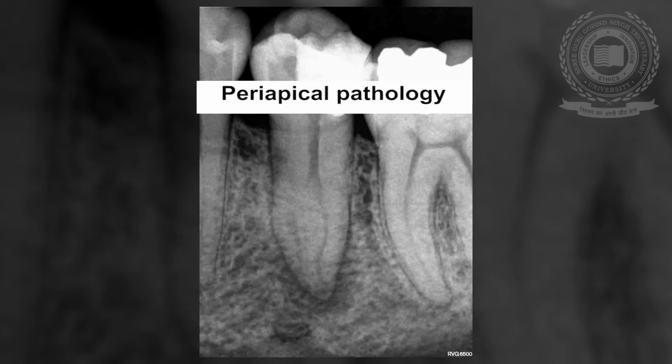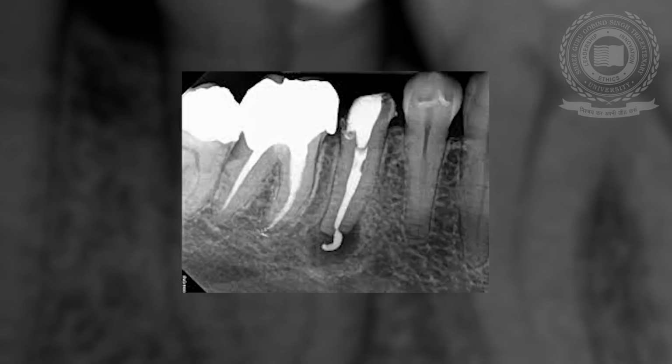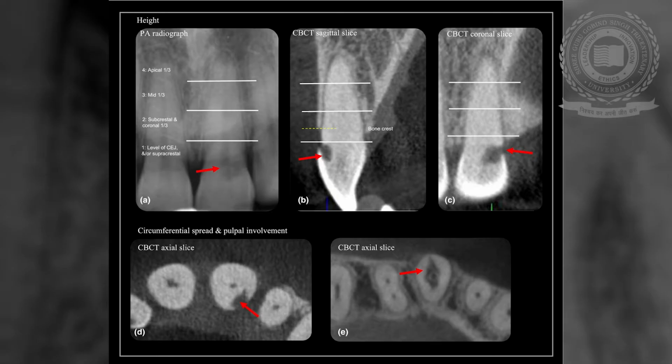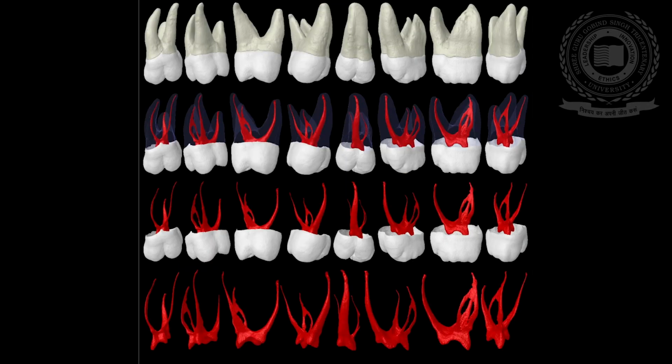Endodontic applications of CBCT include differentiation of dental and periapical pathosis from normal anatomy and relationship with important anatomical structures like sinus and inferior alveolar nerve canal. CBCT aids in management of dens invaginatus and aberrant pulpal anatomy, external resorption, internal resorption, lateral root perforations by a post, accessory canal identification, obliterated canals and canal patency.